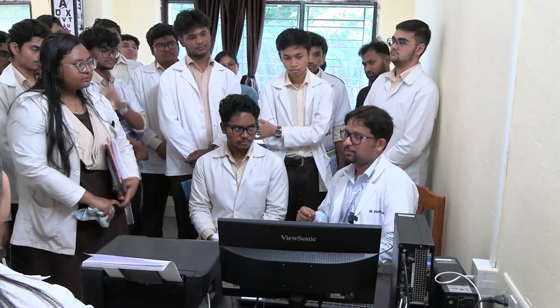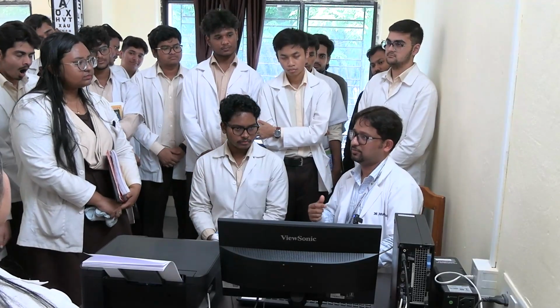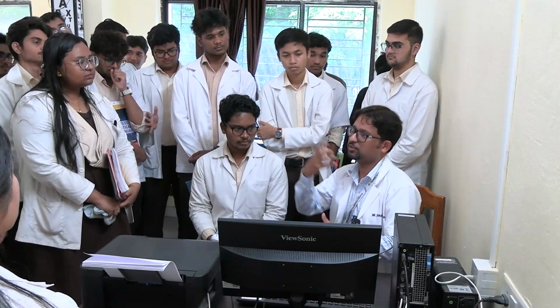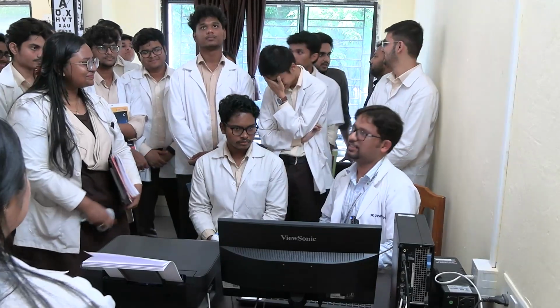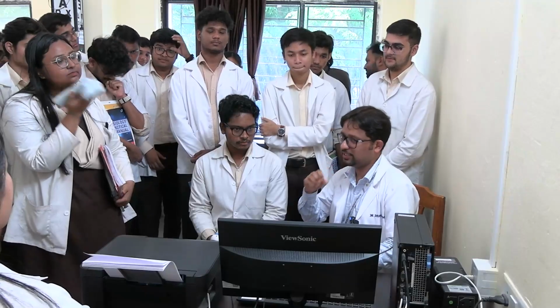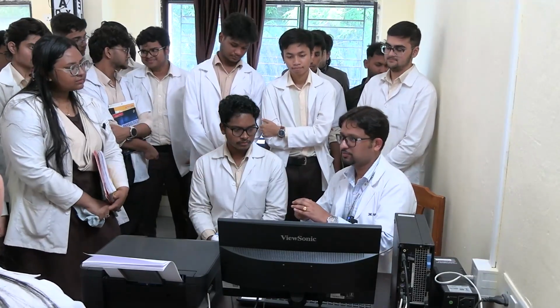So as you can see, as I am taking this deep inspiration, I am slightly extending my neck, right? Because this makes that trachea more in line. Not too much. This is not to be hyper. Don't look upward. Slight extension, 10 to 15 degrees extension, and followed by this, you have to exhale this, right? So suppose I'm holding it in my hand.